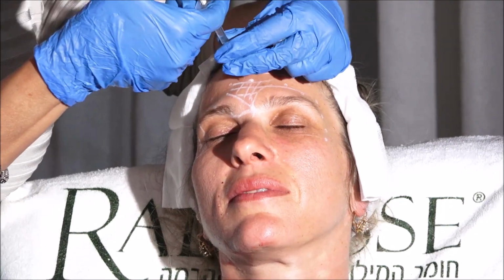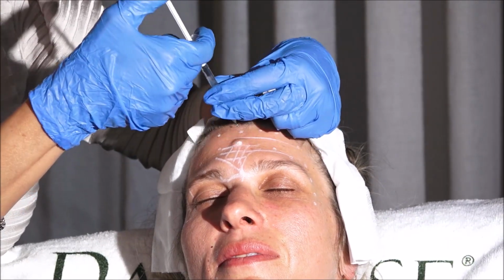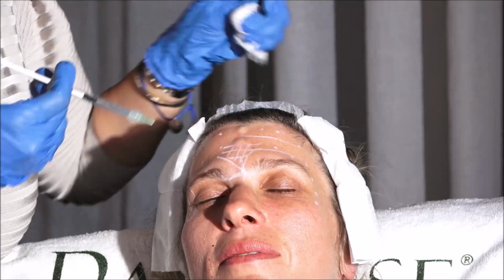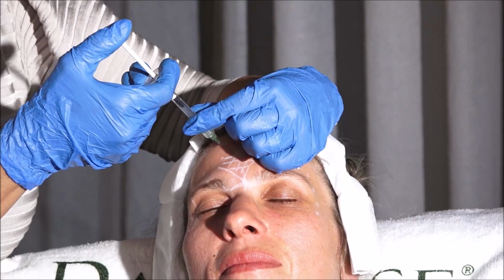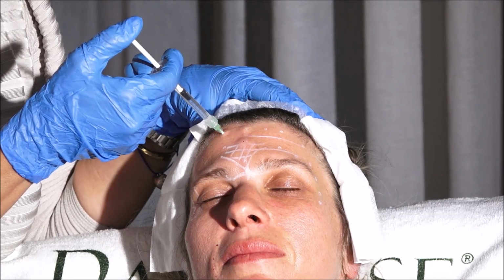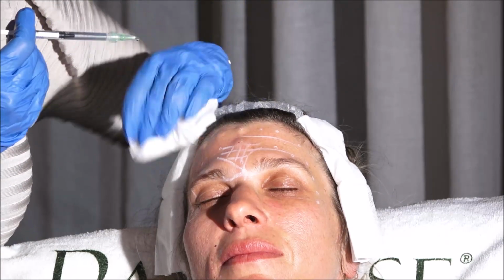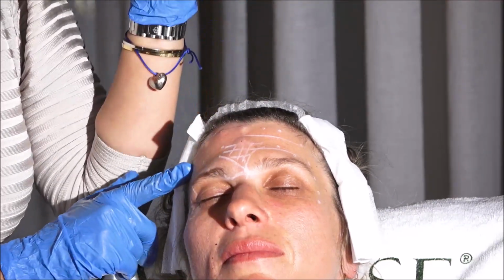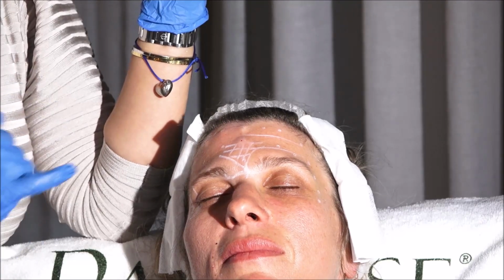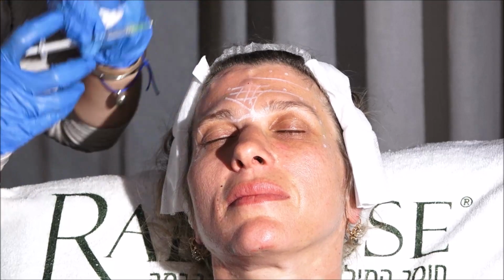Okay. So first point, third, inject 2 units. On the upper part of the face, I give 2 units. 2 units, 2 units. On the lower, I'm giving less, because I don't need that much of a block. So this point will be 2, but then 1 and 1.